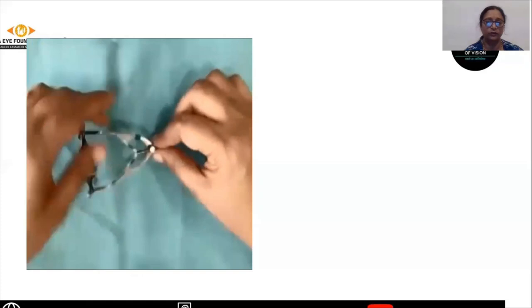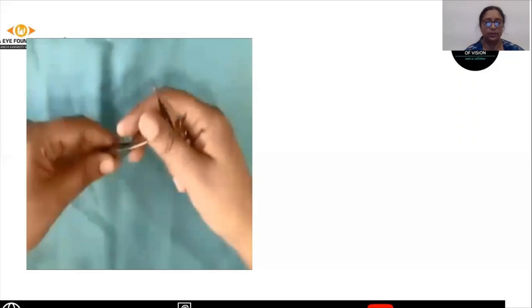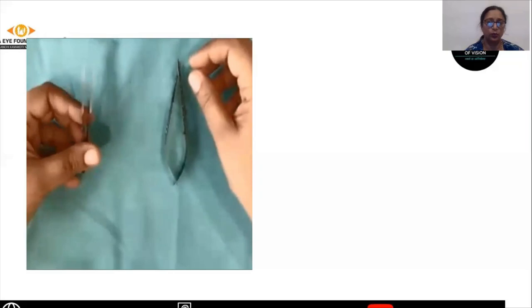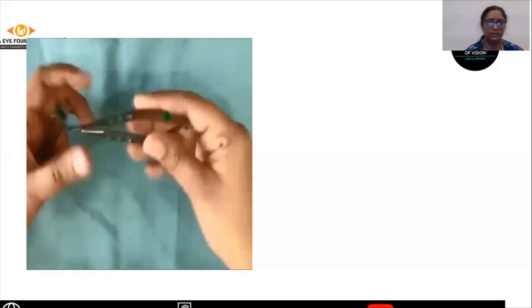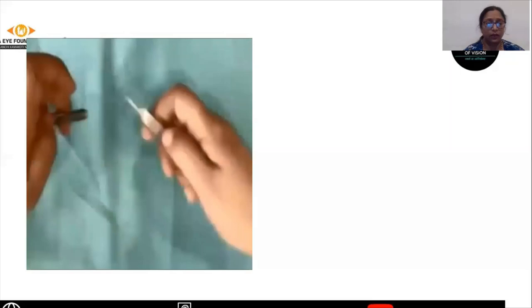The next step in trabeculectomy is doing the peritomy. For doing the peritomy, you need a Hoskins forceps, which is a toothed forceps that fixes the globe, and a conjunctival scissor, also called the Westcott conjunctival scissor.